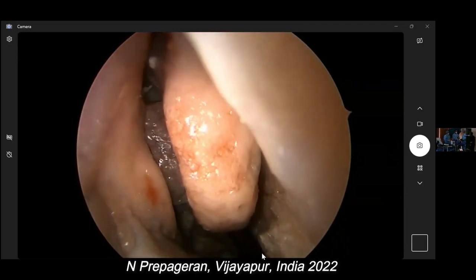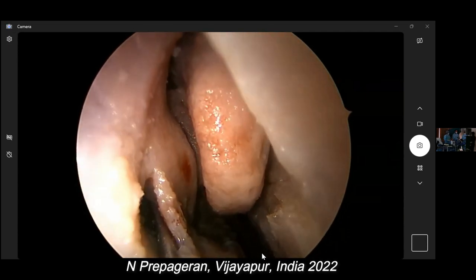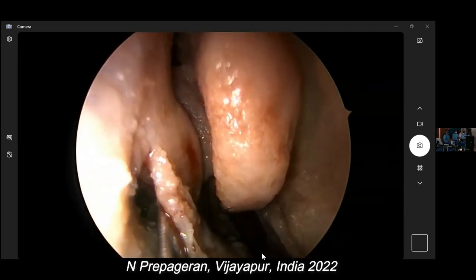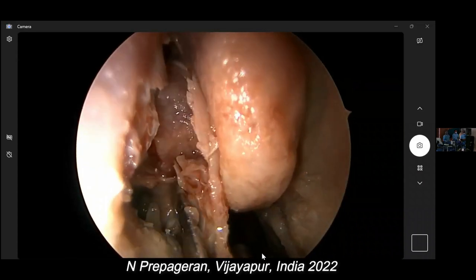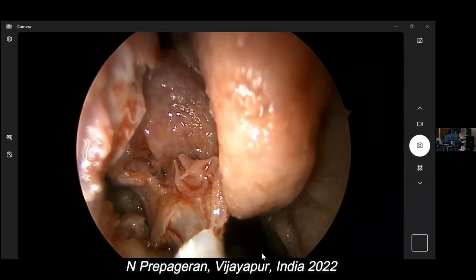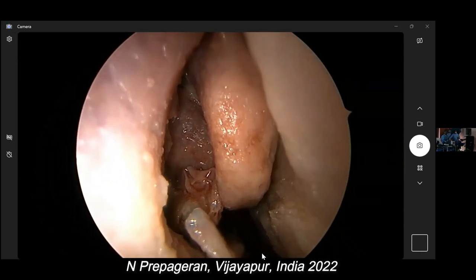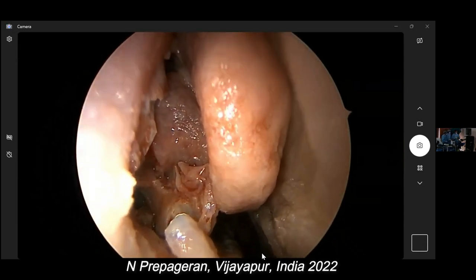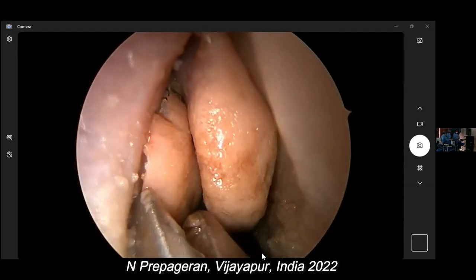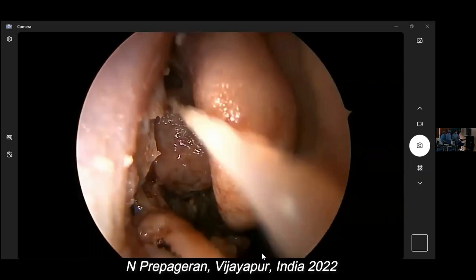If you touch this, you will find where it's moving. So put your Freer elevator into this line. And then what is most important is go inferiorly. When you go inferior, you take off the uncinate process. And when you take off the uncinate process, automatically, you have opened up the maxilla. One simple step. You have done now almost 80% of the surgery by one simple movement of your instrument.